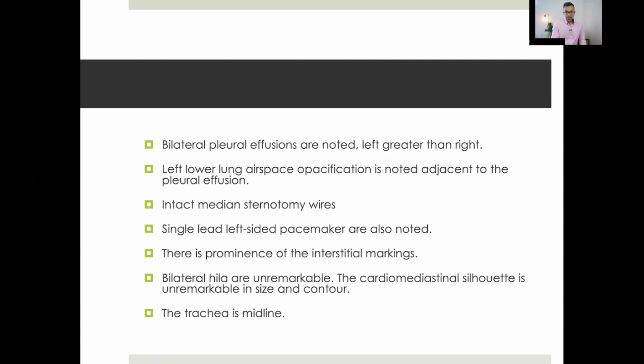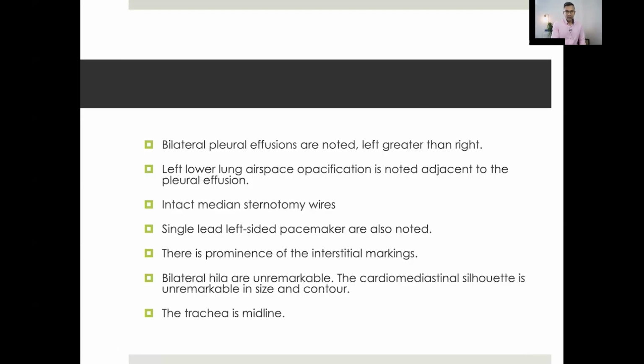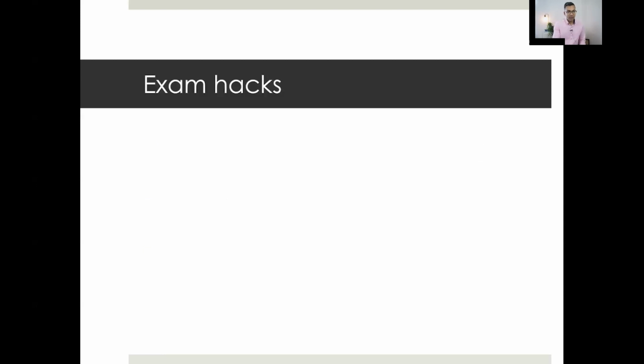That's good. So you got a lot of really useful things out there, and hopefully, again, just having this past history really helps us to go a lot of the way into saying true statements and potentially mentioning relevant negatives as well.